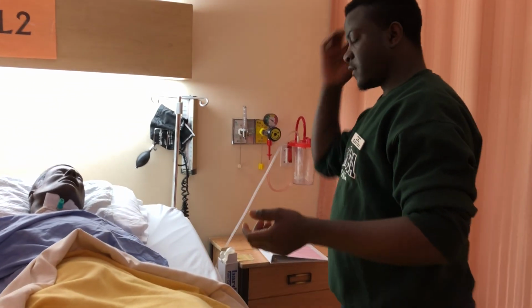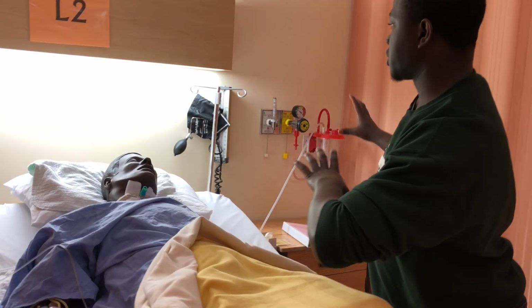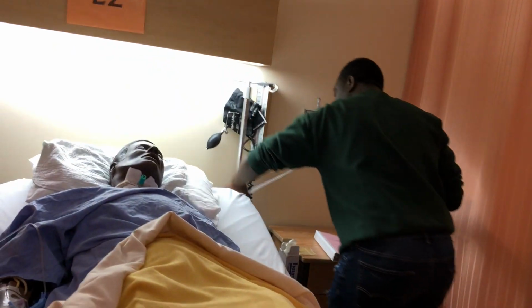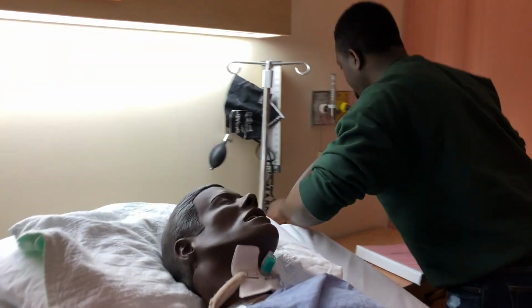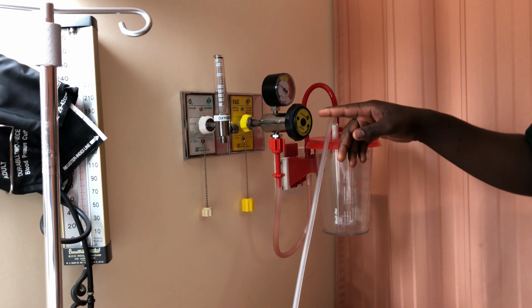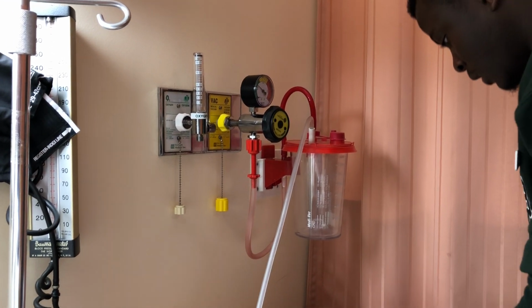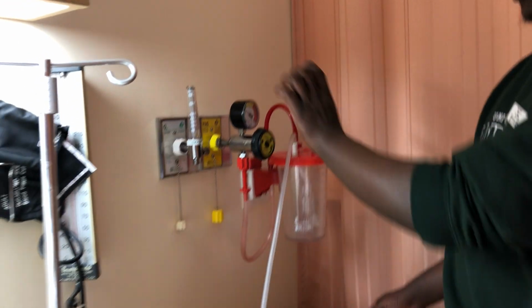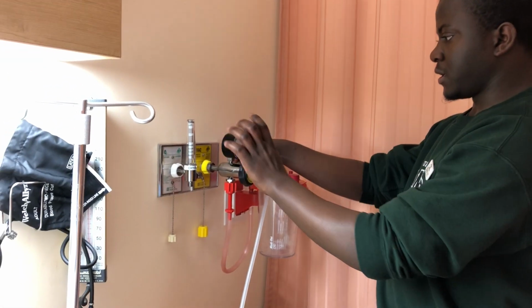Okay, so first off, because the chest tube is connected to suction, I'm just going to make sure that the suction is connected properly. I know this is the suction tube right here and it's connected to suction, and it says connected to low. So I see the suction is connected to low and I know that's the case. So I'll just go around and do my other safety checks.